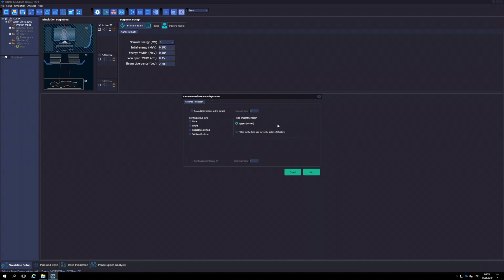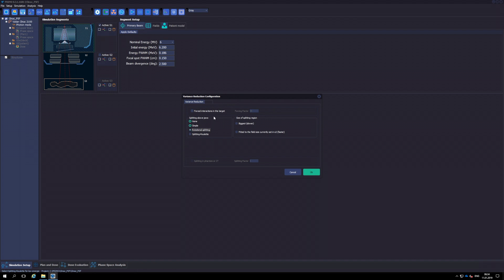The most adequate variance reduction technique for photon beams of 10 MV or less energy is splitting-roulette. For energies above 10 MV, rotational splitting proves to be more efficient. Both splitting-roulette and rotational splitting can be applied to take advantage of the defined field size, or applied for the most general case, that is, the largest possible field of 40x40 cm. If we require these techniques to be adapted to the field size, then the simulation will be more efficient, but the tallied phase space file can only be used for field sizes equal to or smaller than the one defined at Segment 1. On the other hand, a phase space tallied with the biggest option can be used with any field size when subsequently simulating Segment 2.